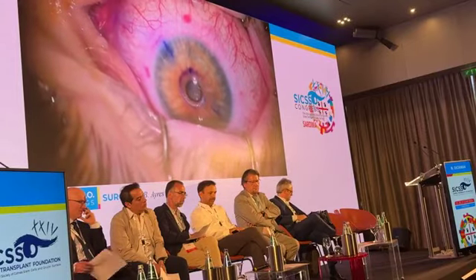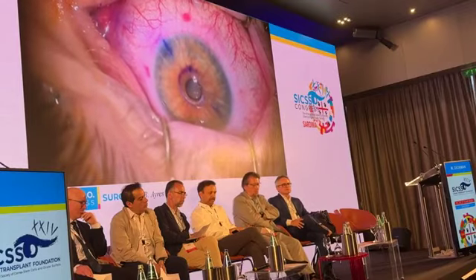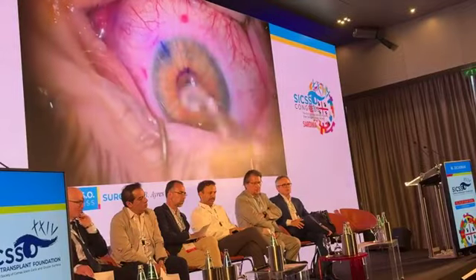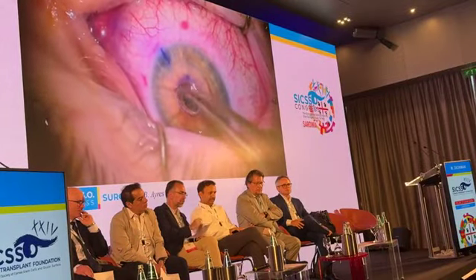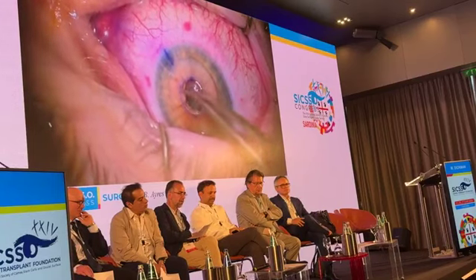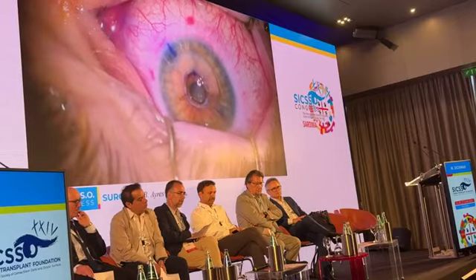Now, a little trick that I learned from Bill Wiley was to take the CTAC segment and put it on the eye, just on the surface of the eye. And what you can't see is behind me on the wall, I've got the surgical plan hanging up.